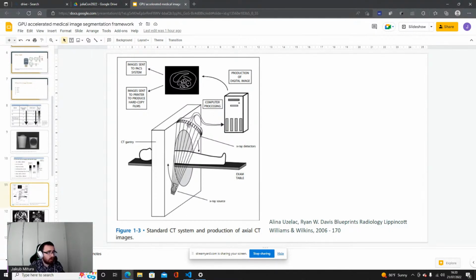So in CT scans, basically what we do is slice the patient. We make a slice of the patient, then go a millimeter or 2 millimeters, depending on the case, to one side, get another slice, and another slice, and another slice. You will see it in a moment. And then we process it, and then we can tell at which point how easy it is for the rays to get through, basically.